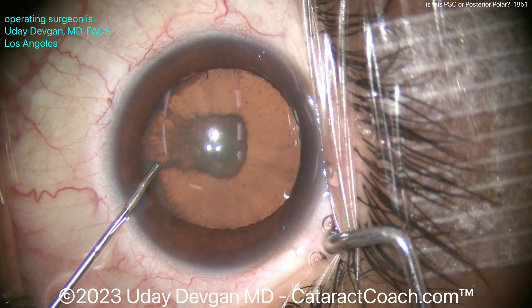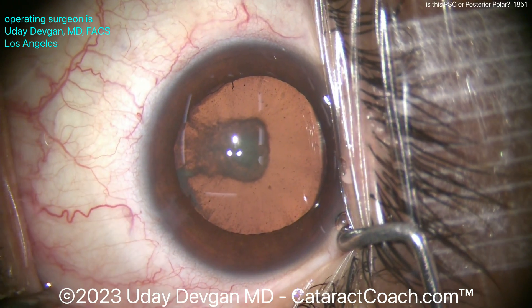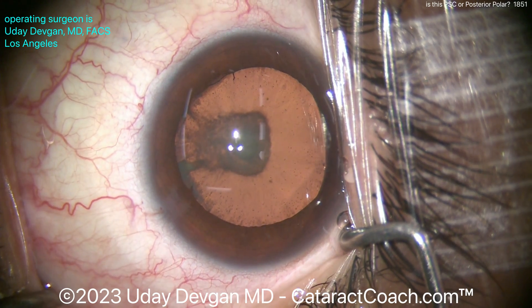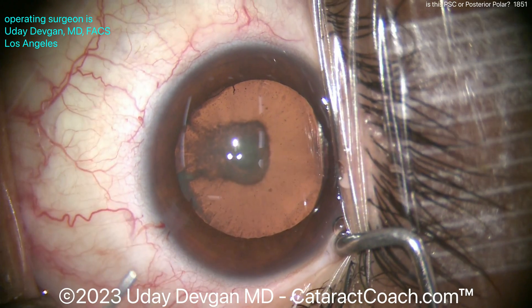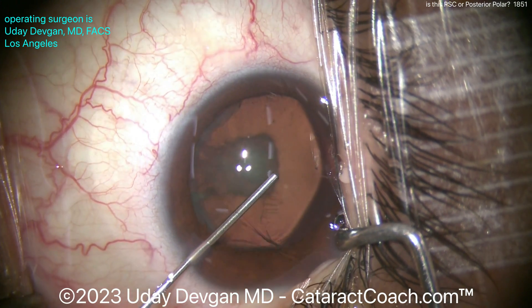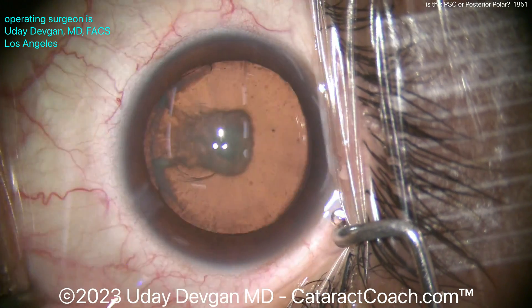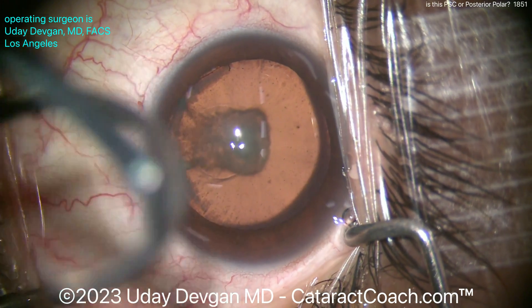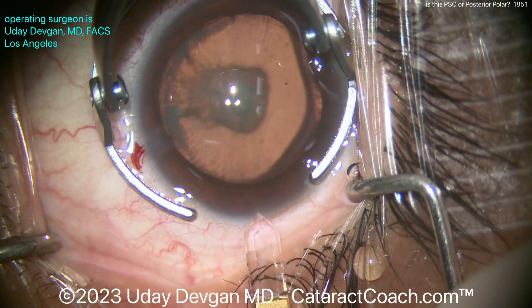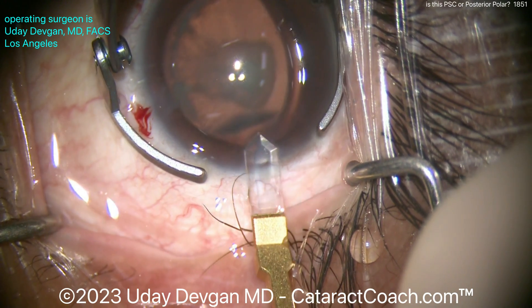In posterior polar, it's a little bit more delineated or demarcated — a smaller, rounder spot that really has a hard edge between where it finishes and the rest of the capsule. In this one, while the very center does have kind of that appearance, maybe it's more PSC than anything else. But the one thing that makes me pause is if you look in the very center, right where those Purkinje images are, there is that one central zone that's just really opaque, and that does look very well demarcated.